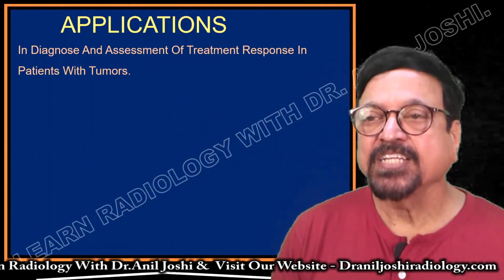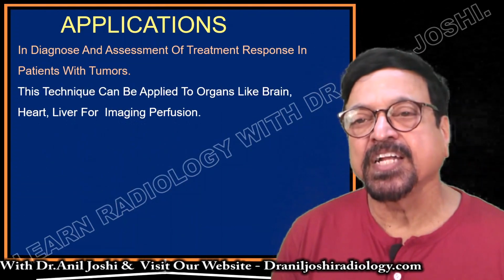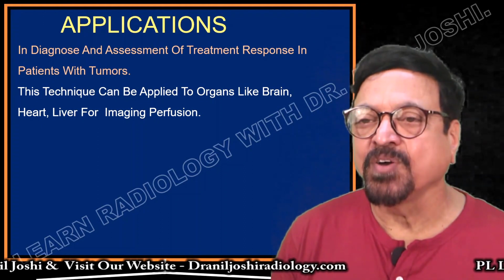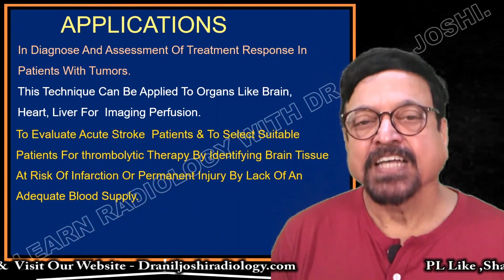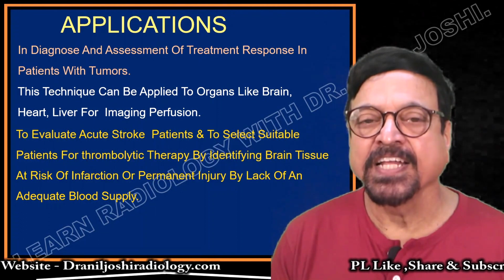Now, the application of perfusion study in diagnosis and assessment of the treatment response in a patient with a tumor is also important. This technique can be applied to organs like the brain, heart and liver for imaging perfusion. As far as our lecture series is concerned, we cover brain and liver only. Cardiac is not covered in our series.